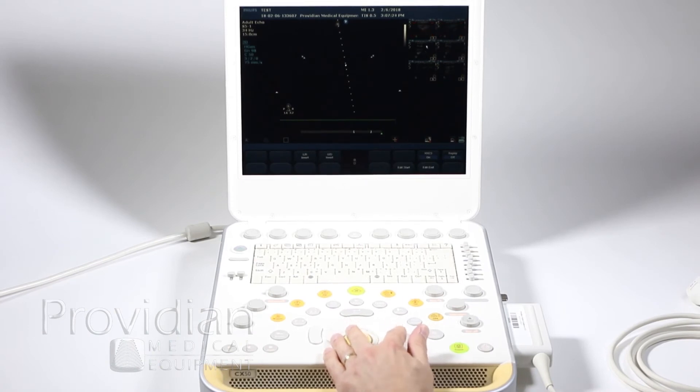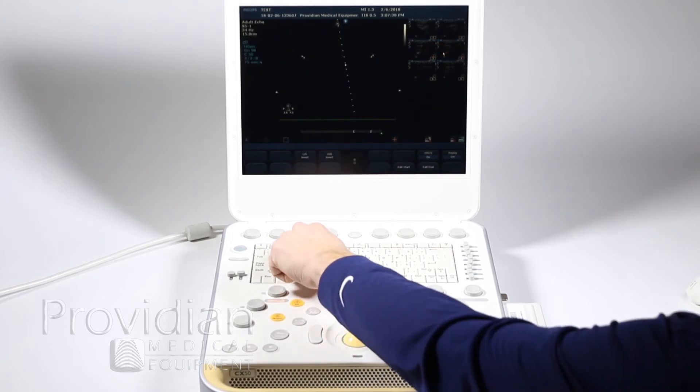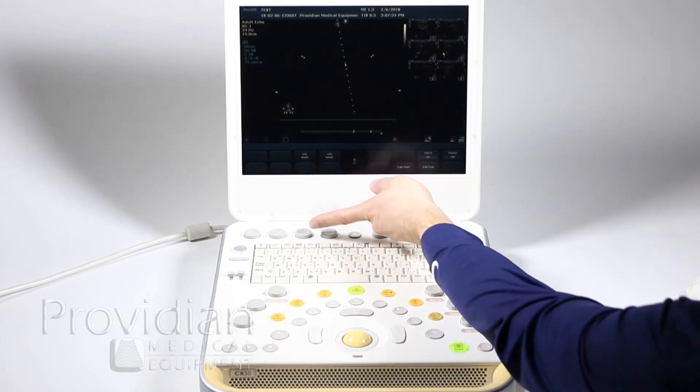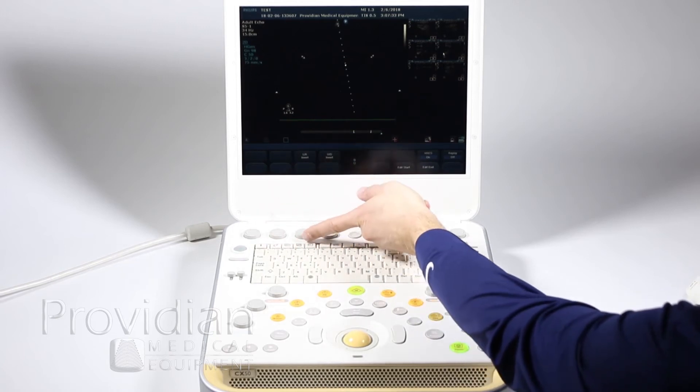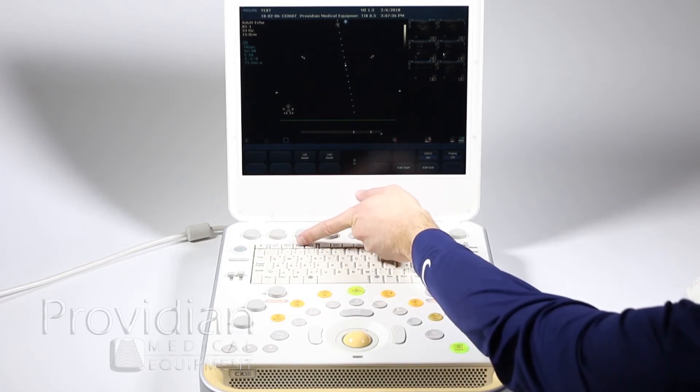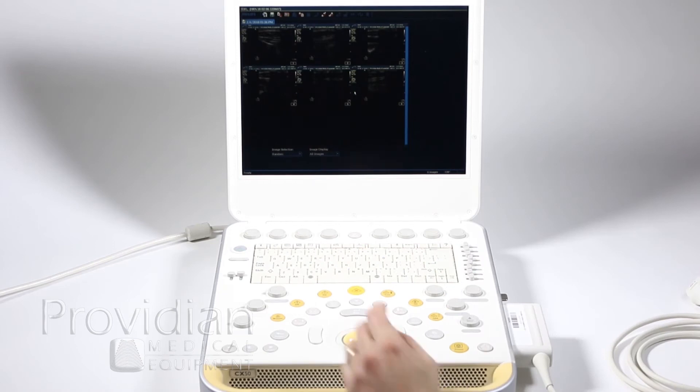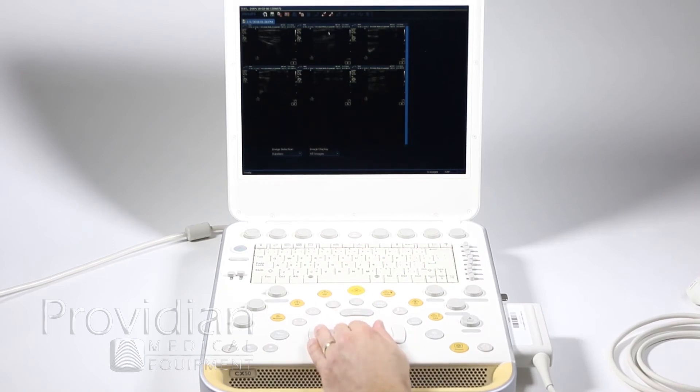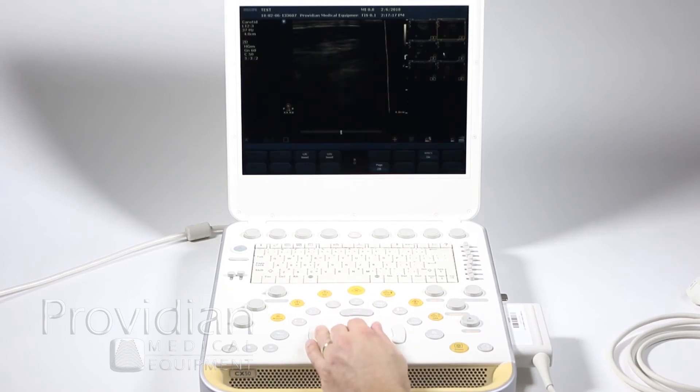Now the same thing can be done at the end of an exam. You can go to review the images by pressing this little icon here—it's right below this third button, it looks like four little sector images on the scan screen.